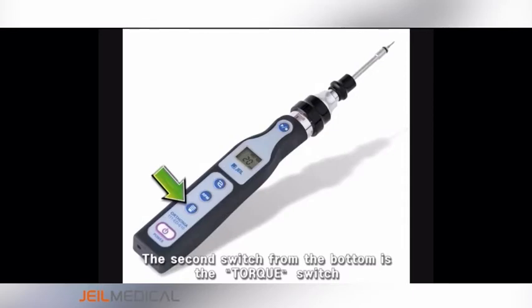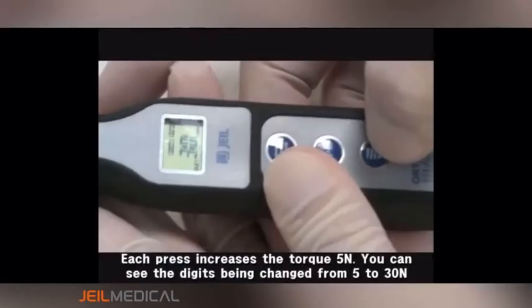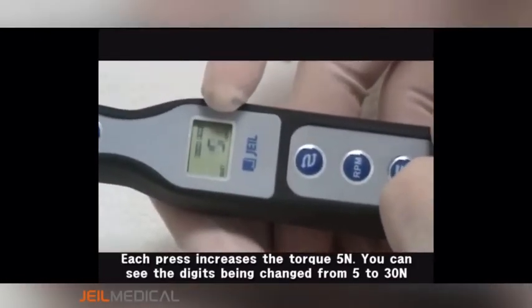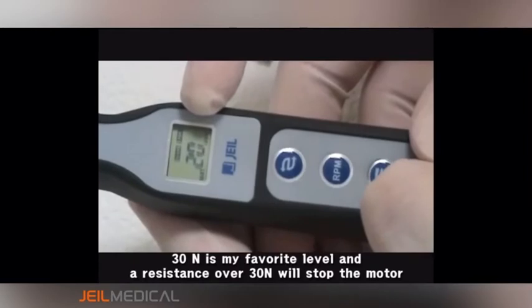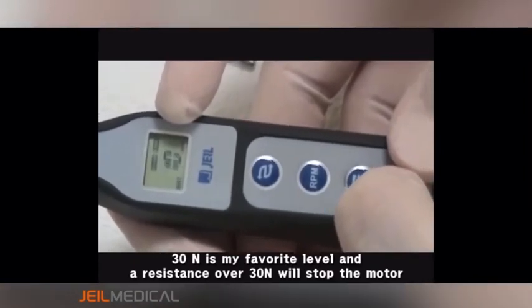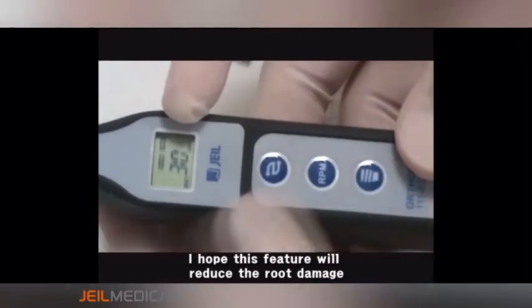The second switch from the bottom is the torque switch. Each press increases the torque by 5N. You can see the digits being changed from 5 to 30N. 30N is my favorite level, and a resistance over 30N will stop the motor.